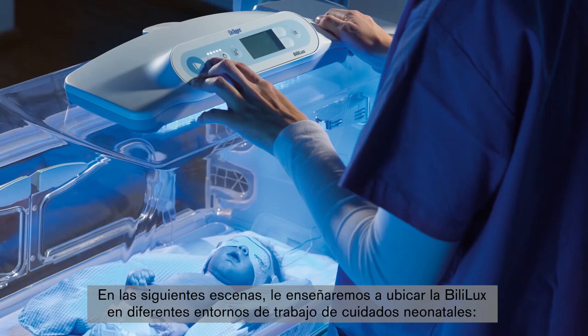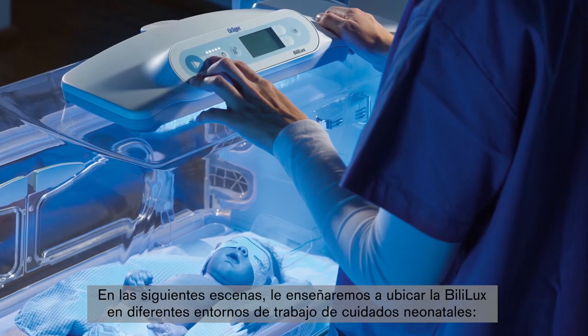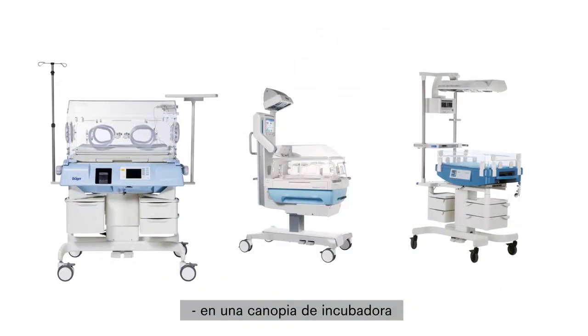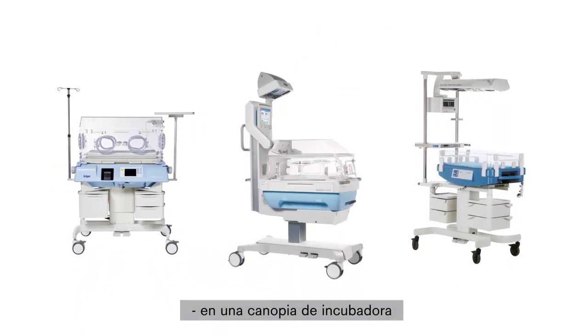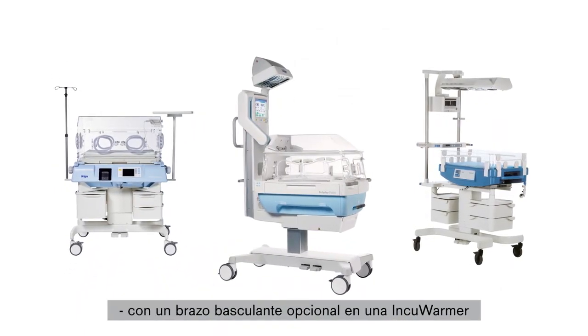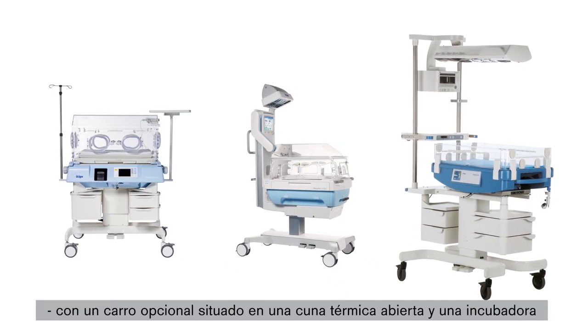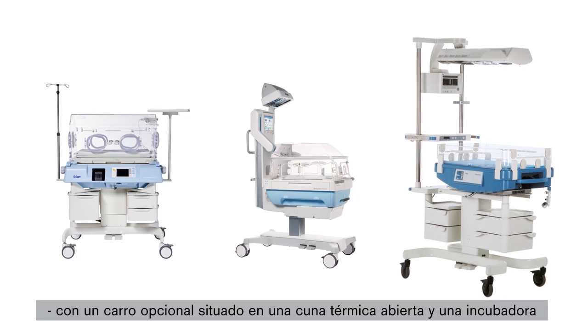In the following scenes, we will show you how to position the Bililux in different neonatal workplaces: on an incubator hood, with an optional spring arm mounted as an INCU warmer, and with an optional trolley positioned as an open warming bed and incubator.